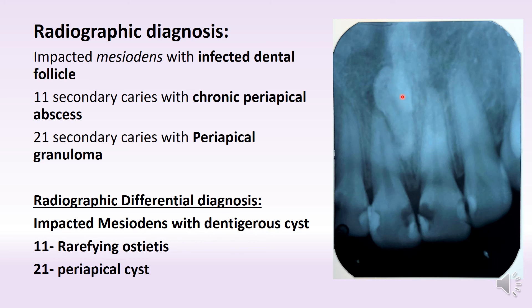Now the differential diagnosis gets interesting because for the mesiodents, when we are talking about an infected follicle, it could also mean that a widened follicle indicates a dentigerous cyst. Now how do we differentiate the two? Generally, in an infected follicle, the follicle should be very irregular.